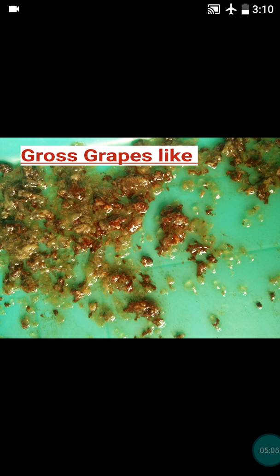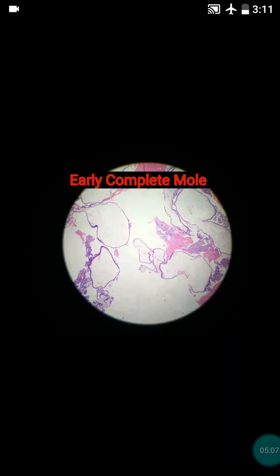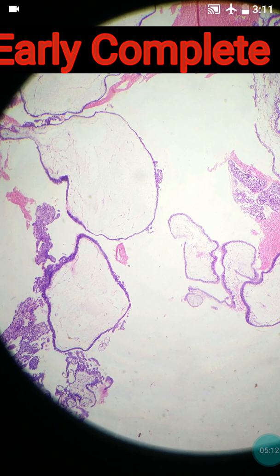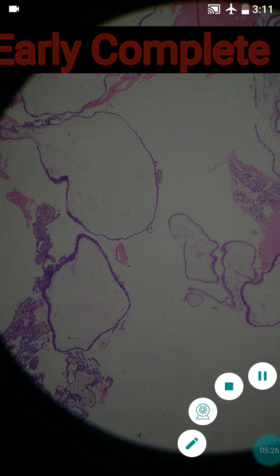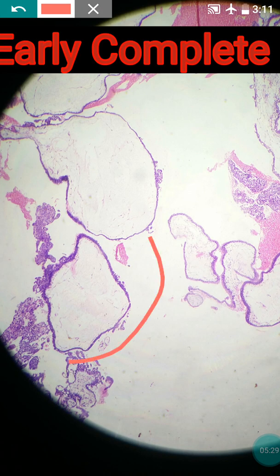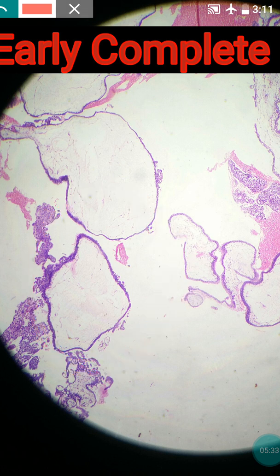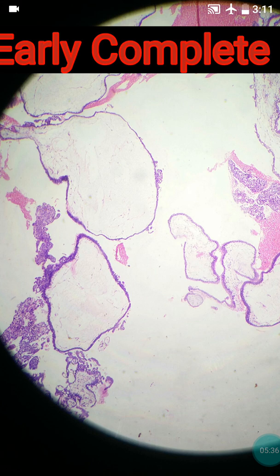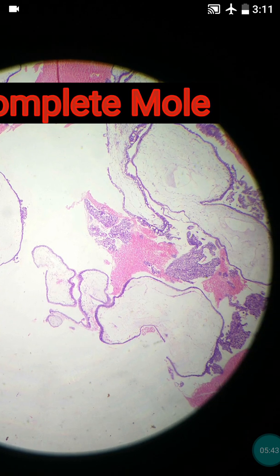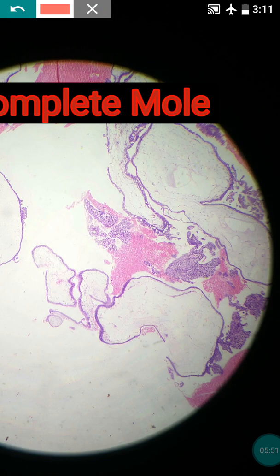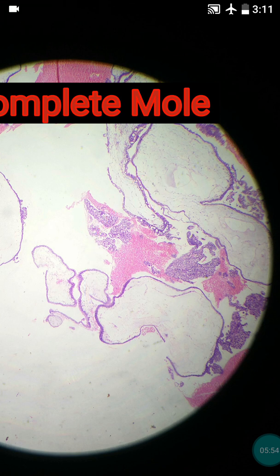The vesicle size can vary from 1 to 30 millimeters. As discussed, you can see the swollen hydropic villi. If you recall, in normal products of conception the villi are not hydropically swollen. In our case, almost all villi are markedly hydropic showing diffuse hydropic change. Sometimes there may be presence of central cisterns, which are formed due to broken strands of fibrillar materials.